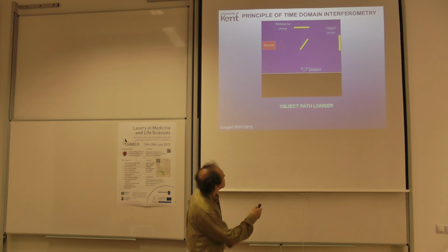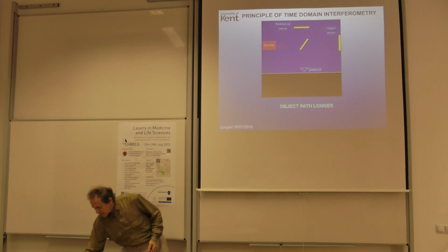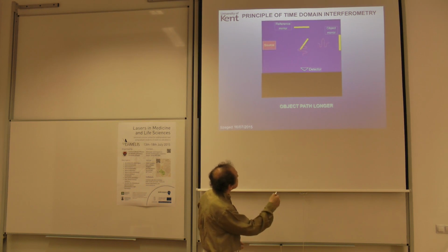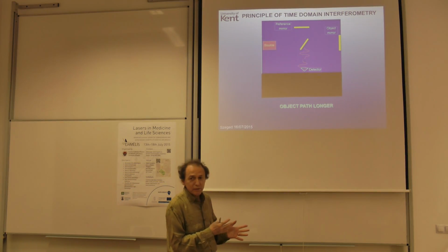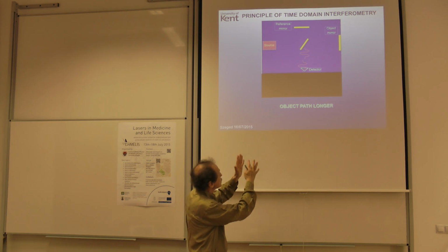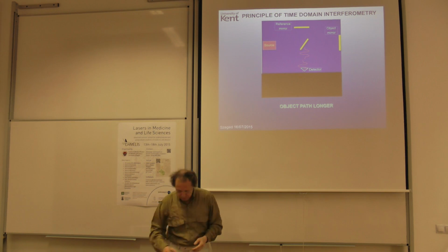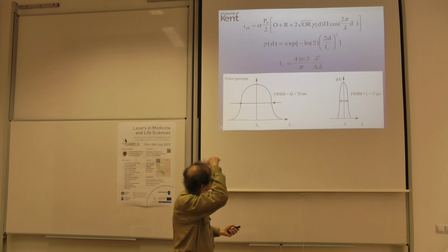However, let's see, now I put the mirror away. So if I start and emit the burst, because this one is longer, when the wave train comes back, it will miss the previous one. So you won't have superposition. Right? So by changing the distance there, I could change the matching condition. I could match the lengths, so I could superpose those two wavelengths. And that is an explanation for what we call low coherence interferometry or broadband interferometry.